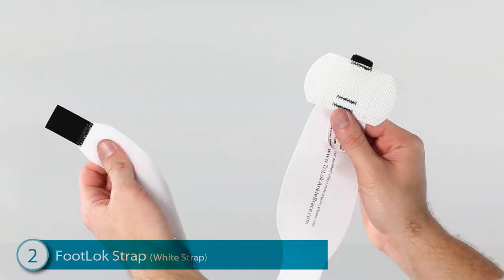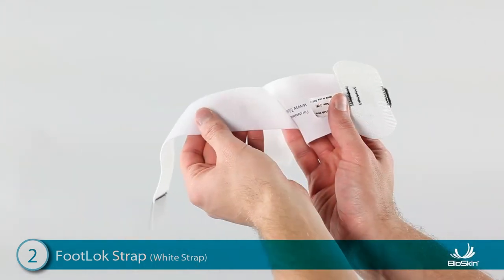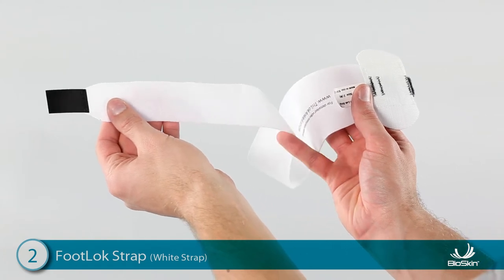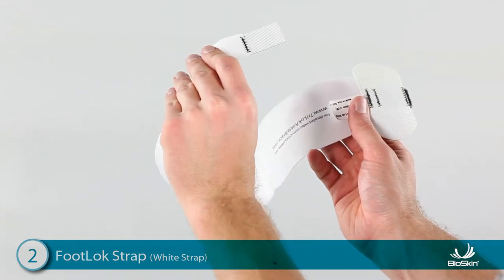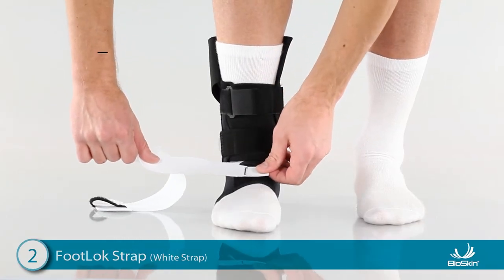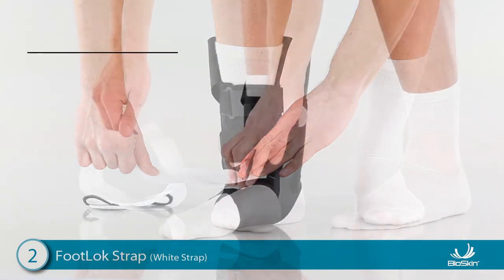Step 2: Applying the White Foot Lock Strap. Hold the strap in front of you and locate the small Velcro tab at the end. This tab is black on one side and white on the other. Place the tab on the top of the foot with the black side down and the strap laying toward the outside of the foot.